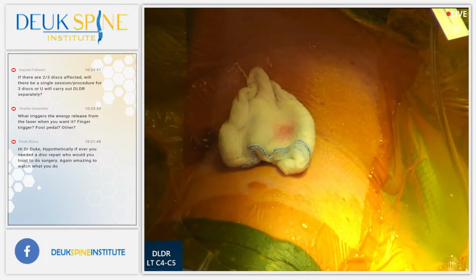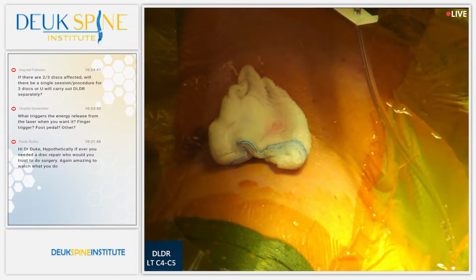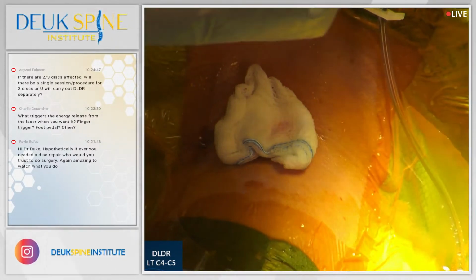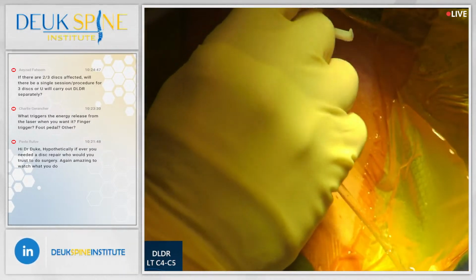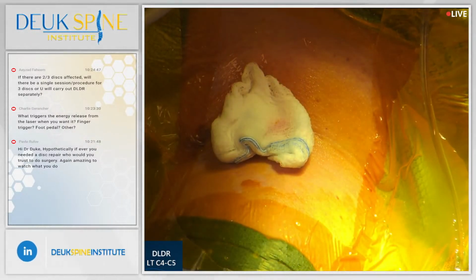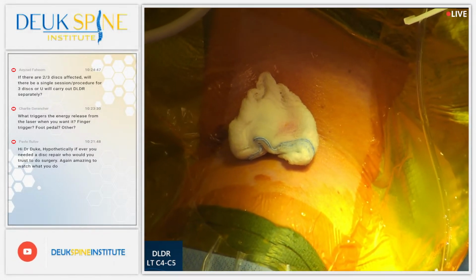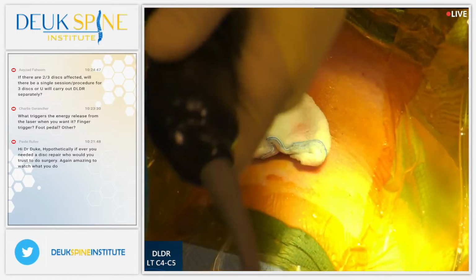All right, Henry, any other questions? Just one final question coming from Izod once more on YouTube, asking, if there are 2 out of 3 discs affected, would there be a single session/procedure for 3 discs, or you will carry out the DLDR separately? Great question, Izod. We do, for sure, we do multiple discs in one session. I'm the first in the world to do that.